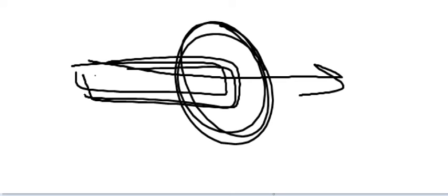So, how much does the table move for every tube rotation in the spiral CT? Maybe in one rotation we move the whole chest? It's possible. We said the tube is rotating and the patient is moving. So how fast the patient is moving compared to the tube rotation? This is what is called pitch.